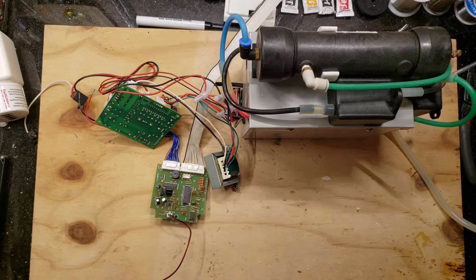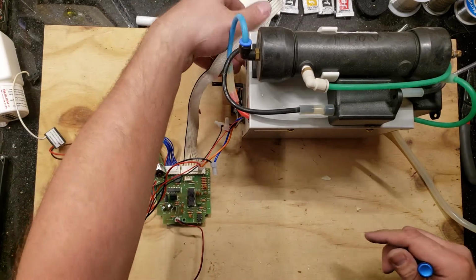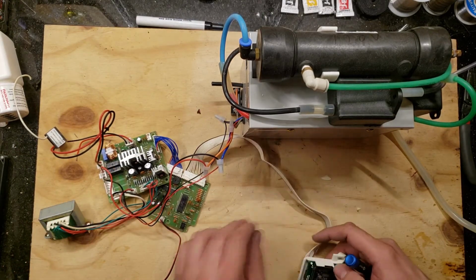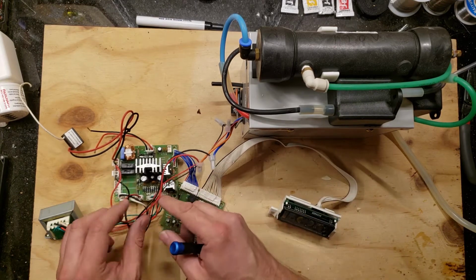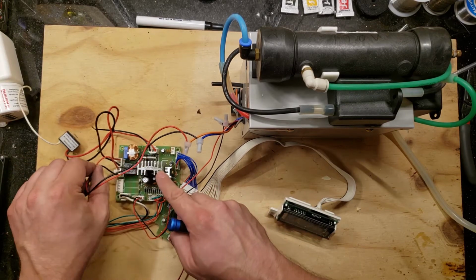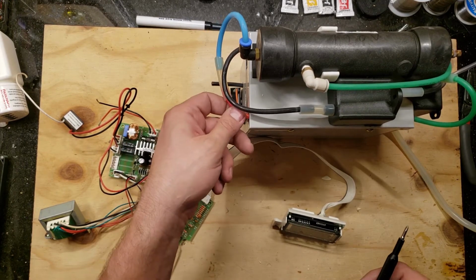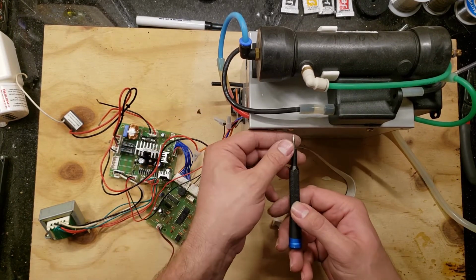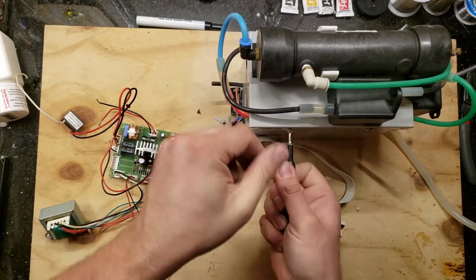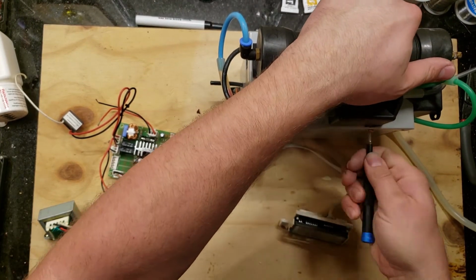So it appears that the integration of the coin operation is actually pretty deep. I thought it was going to be bodged onto a switch or something, but no. Okay, and so the compressor looks like it runs off 120 volts. So this concerns me a bit. I want to give it a fair test to see if it's actually enriching air or not. So I'm going to open this up and see what this hose fell off of, and then we'll do a little bit more testing.